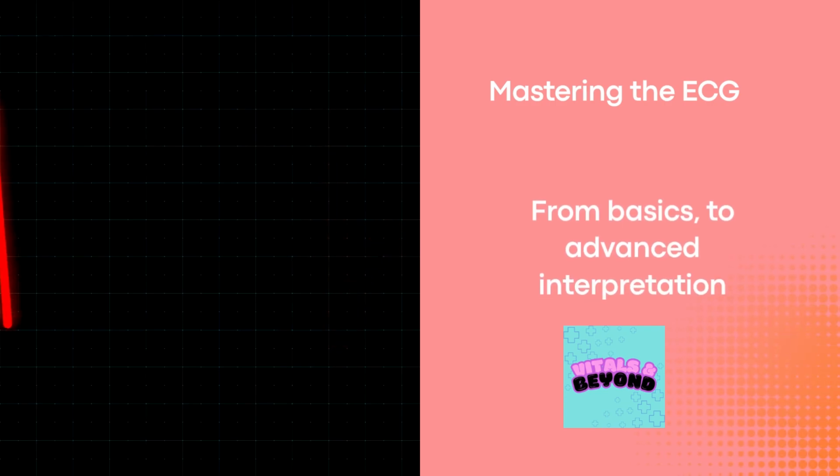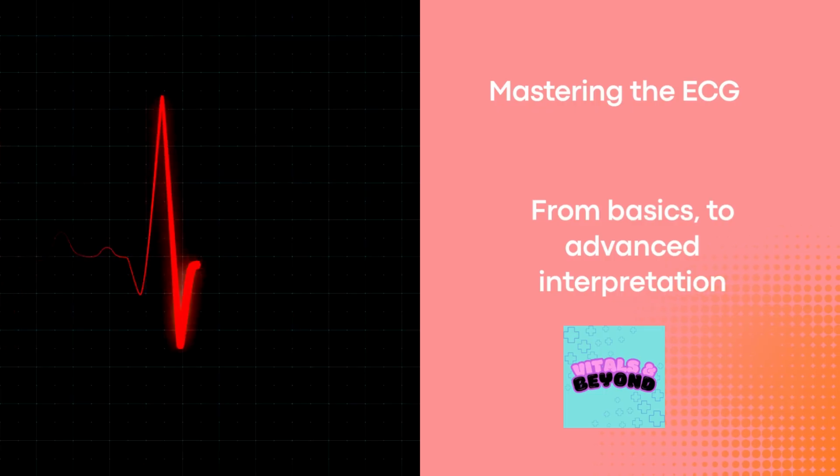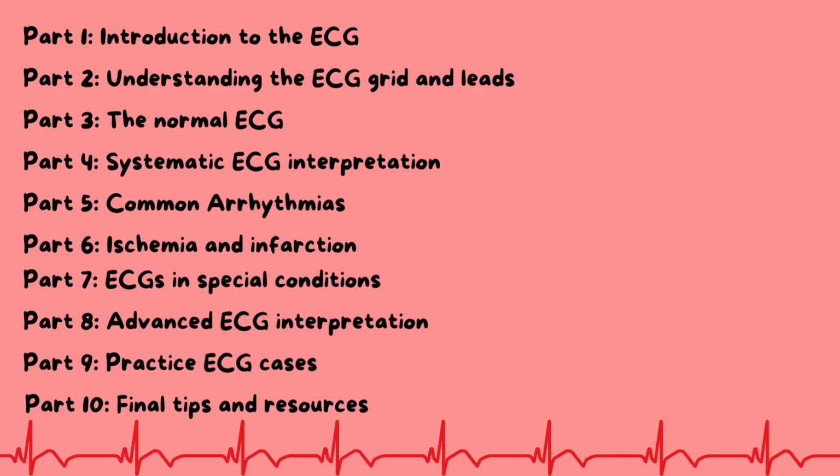Welcome to Mastering the ECG, your complete guide to understanding and interpreting electrocardiograms. From basic waveforms to advanced clinical patterns, this series will teach you everything you need to know about reading ECGs with confidence. This is a 10-part series.